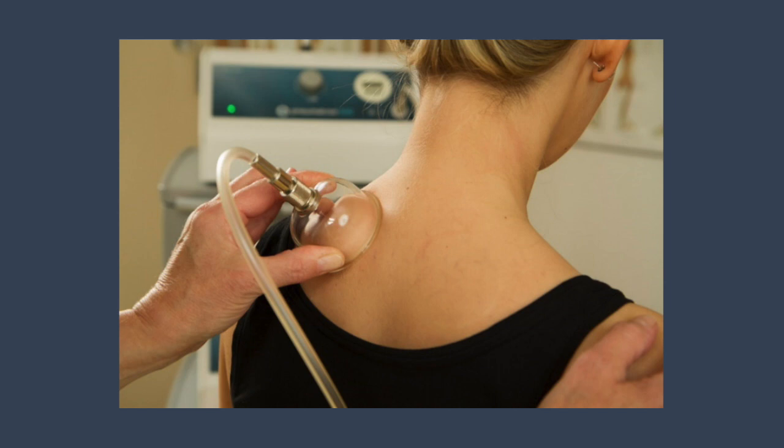Here you can see the application of the large genuine glass cup in the shoulder area. If you oil the skin well beforehand using pain alleviating oil, for example, then the active ingredients can also work better and be better absorbed. When combining with injections, please be sure to use PPTM first.